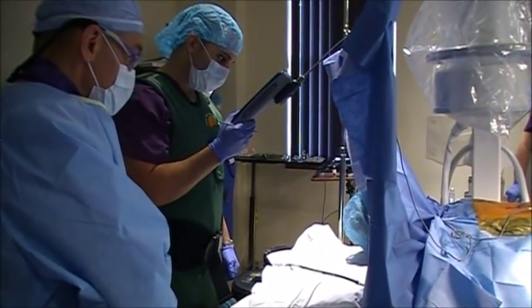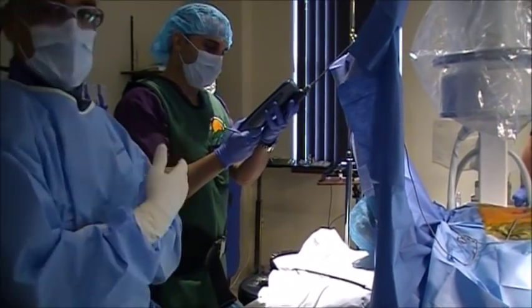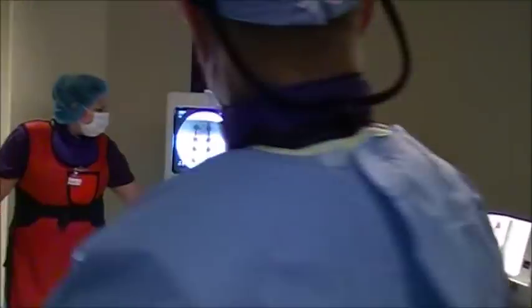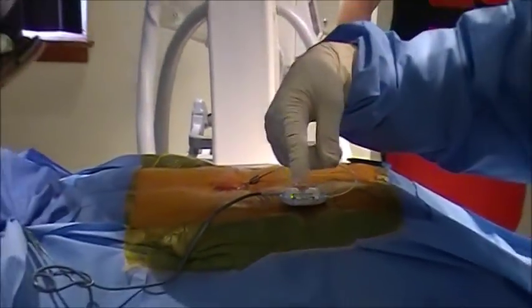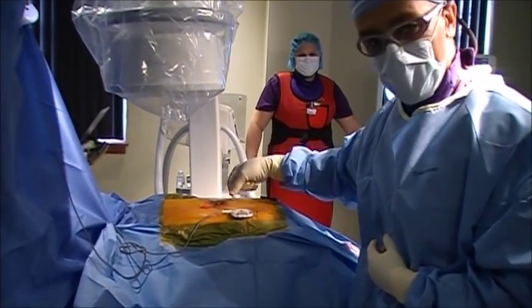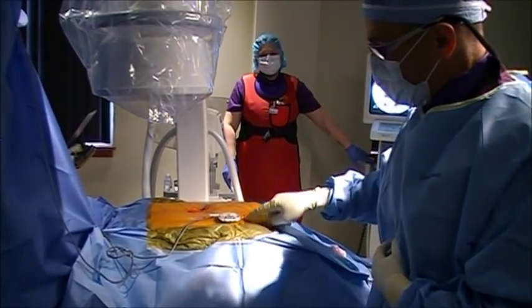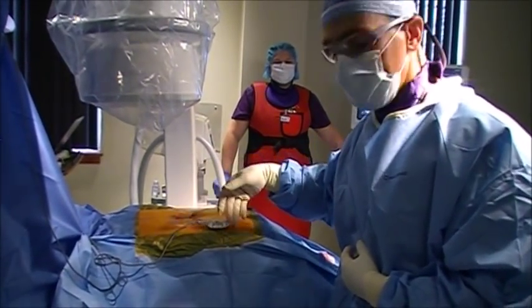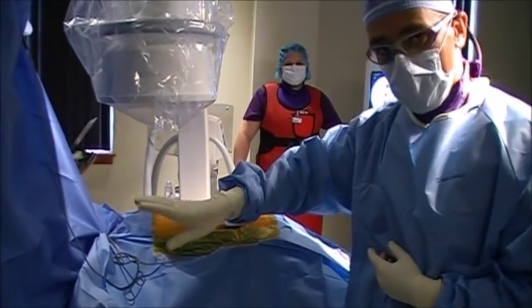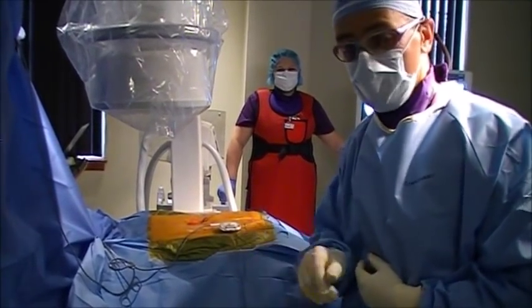She wants the stimulation turned down just a little bit. The Medtronic representative will adjust that. Looking at the fluoroscopy, the distal lead is just at the middle of the T8 vertebral body, slightly left and right of midline. Now that she feels it in a good area, I'm going to make an incision and anchor the wire down, then make a separate incision to create a pocket for the battery and connect the wire to it. It's important to note that patients need to be cooperative during this procedure, though they can be sedated.